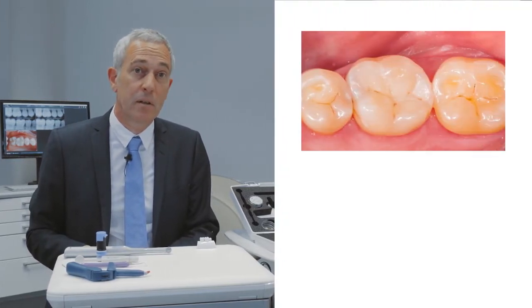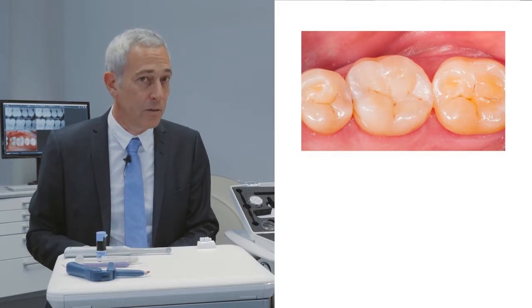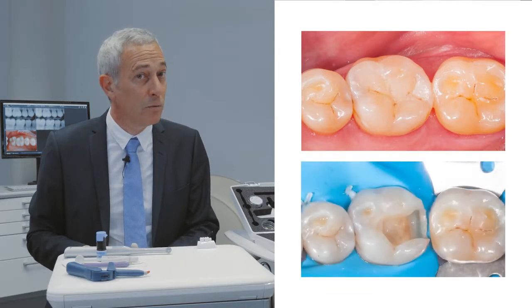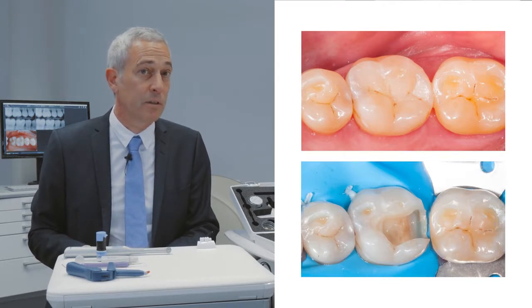Using adhesives and composites, it's also called adhesive dentistry. Here you can see an example. Can you see the restoration? Even now, when you know where the restoration is, it's invisible. This is what you can achieve with modern dental adhesives and composites from DENTSPLY Sirona.